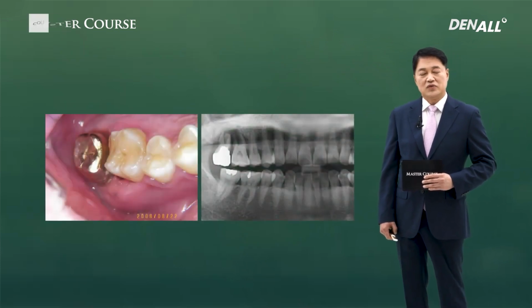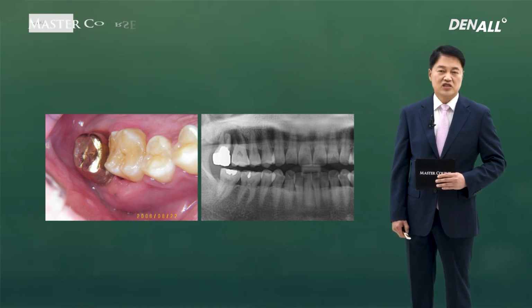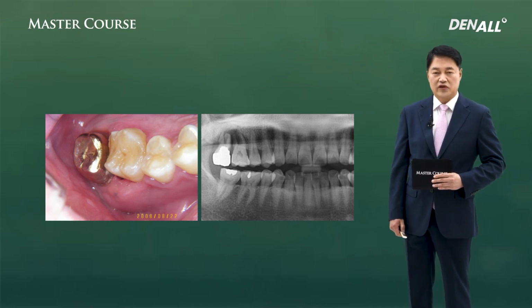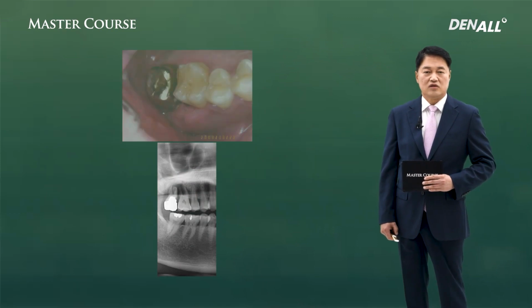As you can see, in number 16 and 17, there was chronic periodontitis. The patient wanted implant and the patient had a lot of fear, and immediate implant placement was planned and appropriate GBR was also planned. This is before surgery and clinical image.